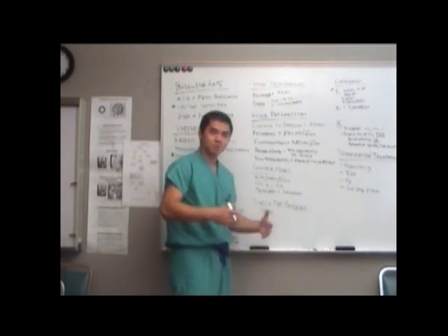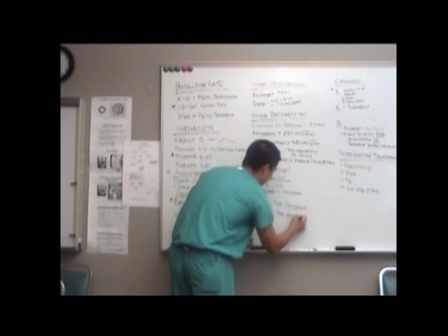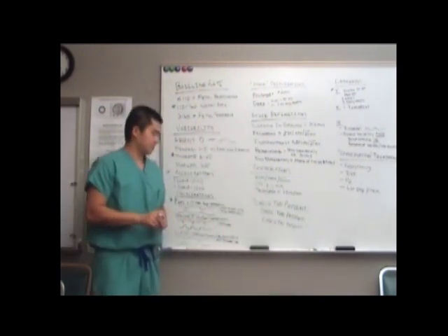Correct, check the patient. So again, the first thing you do is you check the patient. Because the last thing you want to do is call the laborist because you have a big decel and you're freaked out.